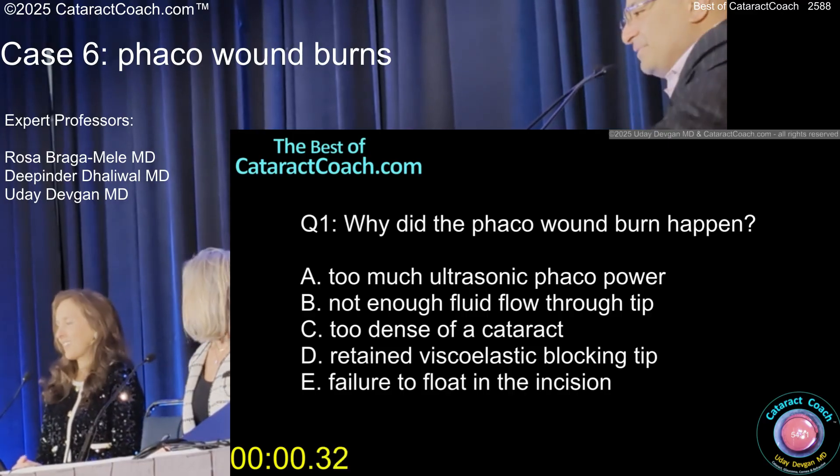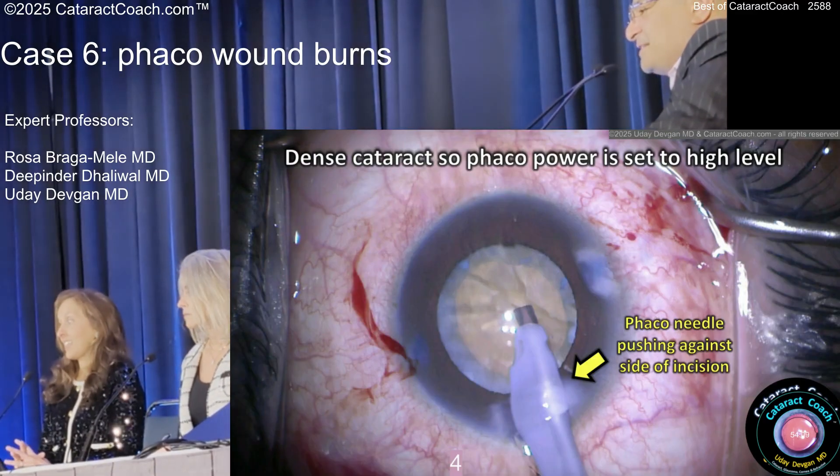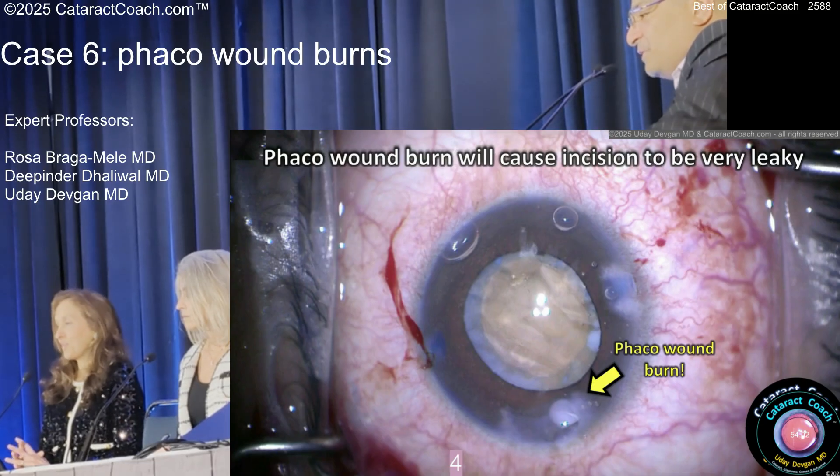Let's see what we're doing here. There it is — that's the power. The needle's pushed up against the side of the incision, it's not floating within the sleeve. That's why we use these slightly leaky incisions, that's why we have that sleeve. And there's the burn.